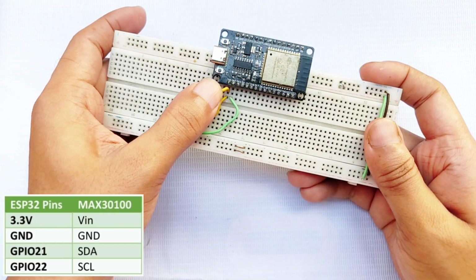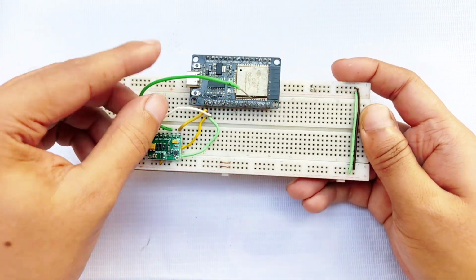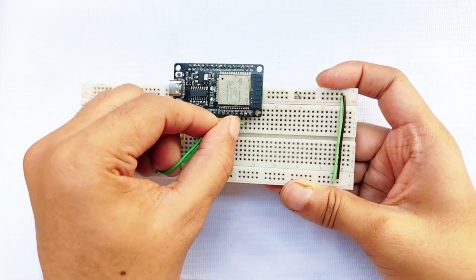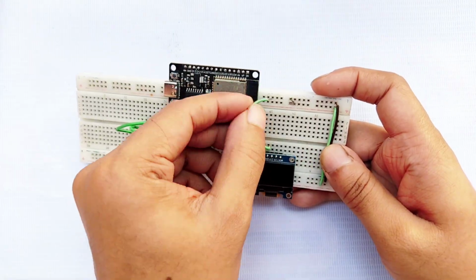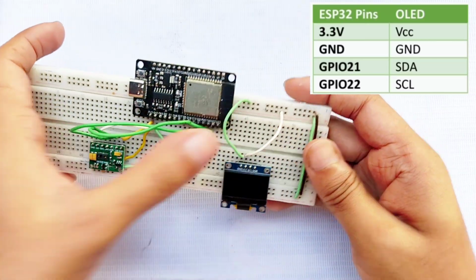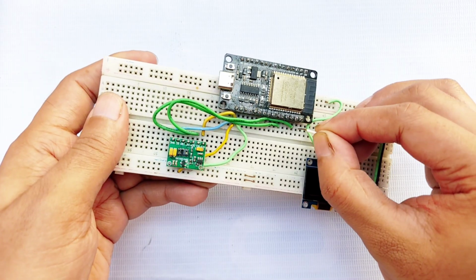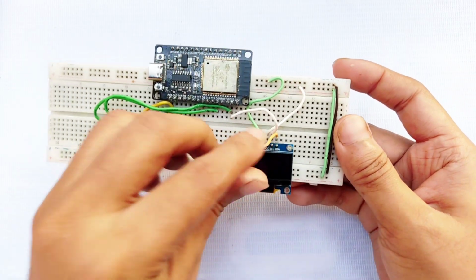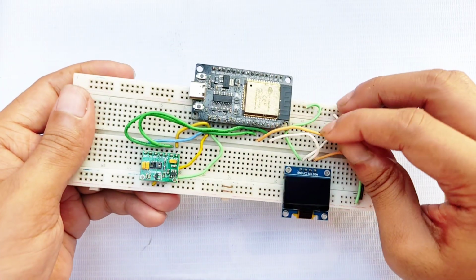Now, wire the sensor. VIN to 3.3 volts, ground to ground, SDA to GPIO21, and SCL to GPIO22 of the ESP32. Then place the OLED display and connect its VCC and ground to the power rails. Connect the SCL pin to GPIO22 of the ESP32, and SDA to GPIO21 of the ESP32.